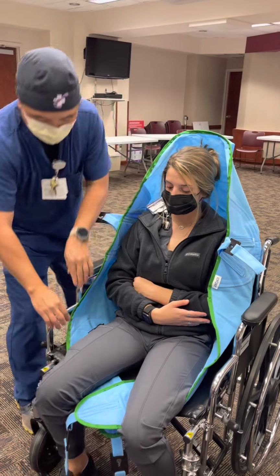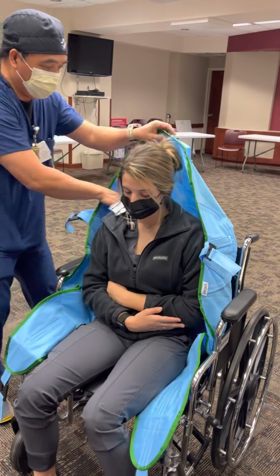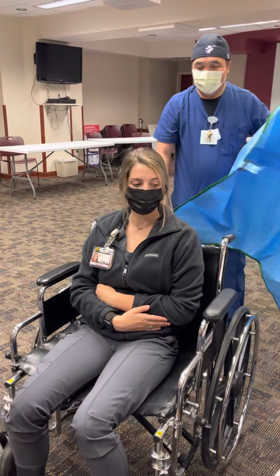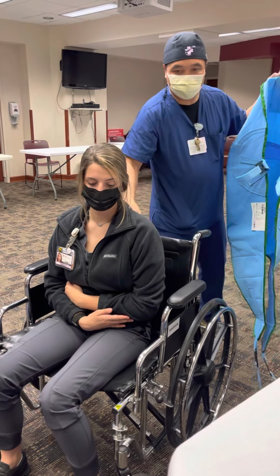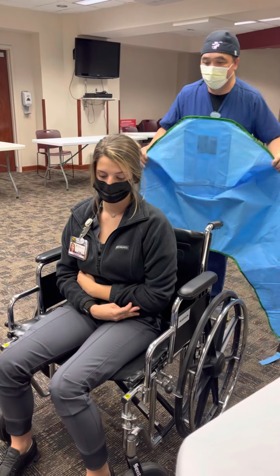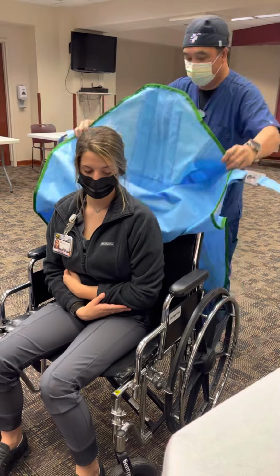To take it out, just pull it out from under her right here. Make her lean forward a little bit and pull it out. Okay. Now let's say this is a recliner. Definitely make sure that the patient is padded and everything before you take it out. To put it back, because you're ready to get the patient back in the bed, just do the reverse.